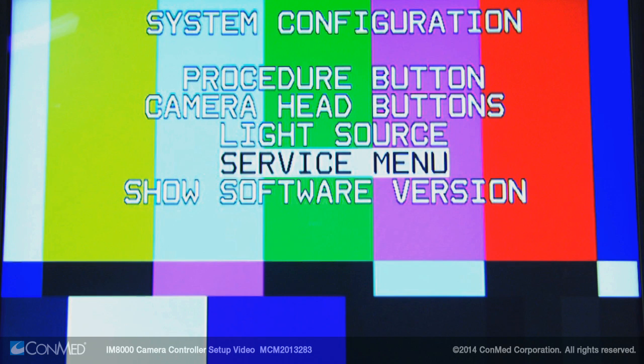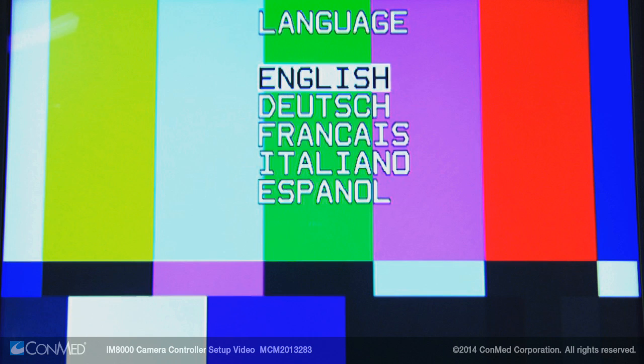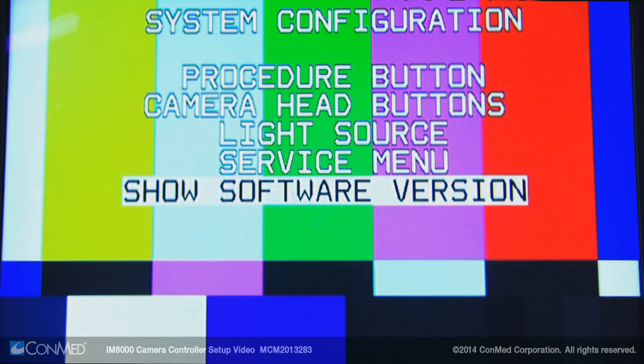Back out of this menu by pressing the menu button and select the service menu. This provides the option to have the on-screen display appear in five different languages. Use the arrows and select button to confirm the desired language. You can also choose between 50 or 60 hertz depending on the video standard of your country. The final menu option, Show Software Version, displays the software version loaded on the IM8000.